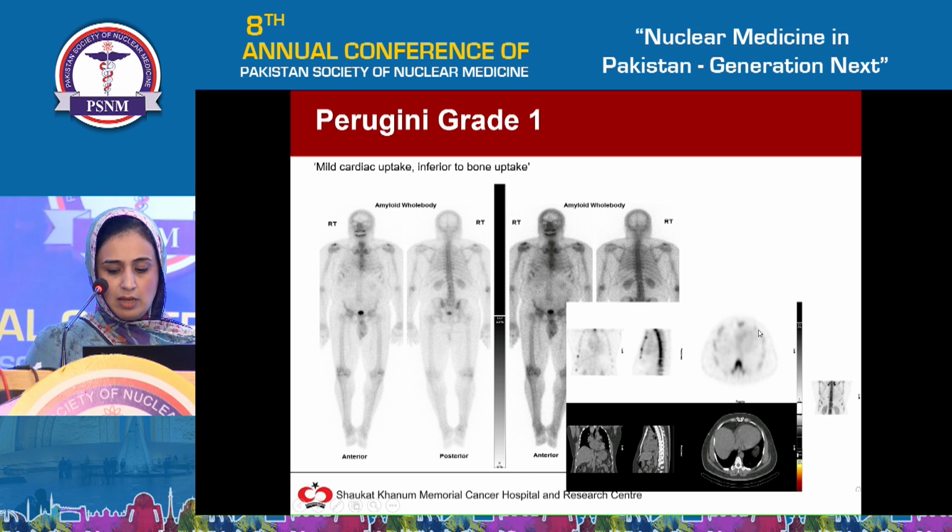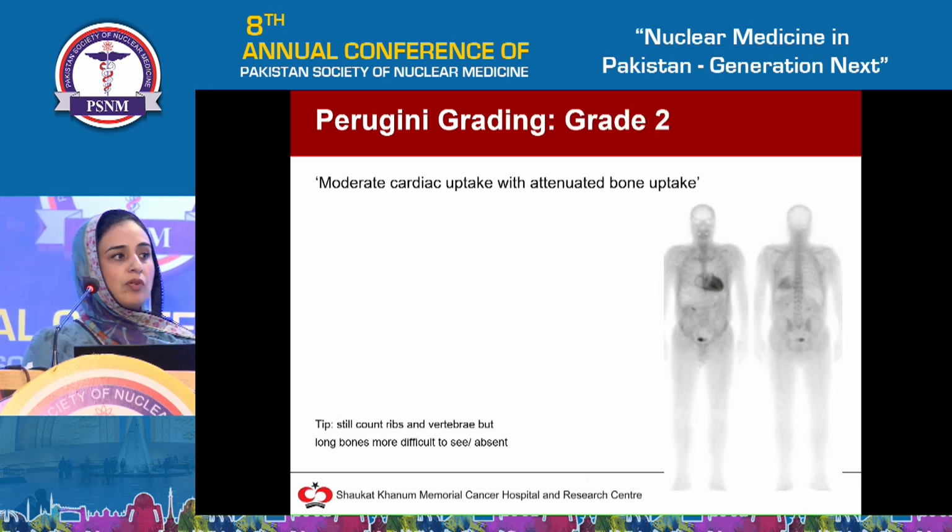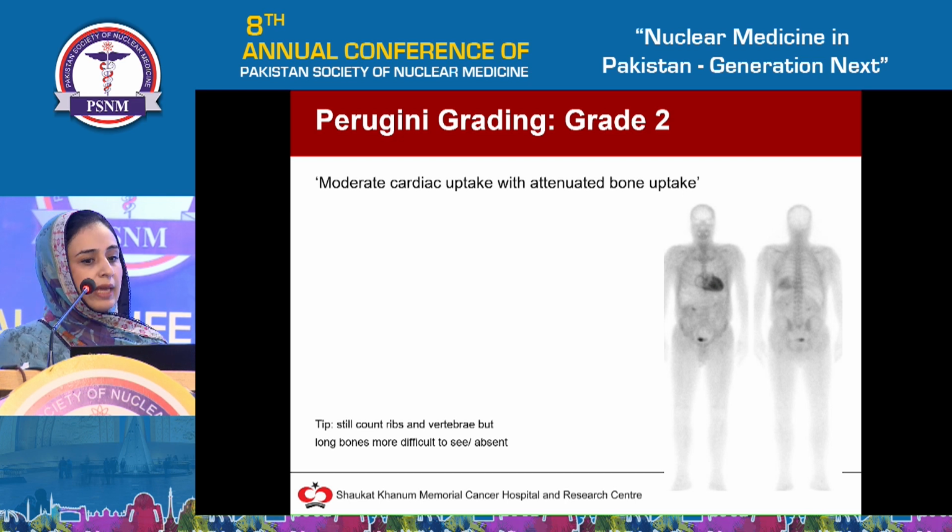So these will fall in grade 1. Got some examples of grade 2 as well. You can see there's moderate cardiac uptake, and the bones are looking attenuated. So heart uptake is more than the bones.